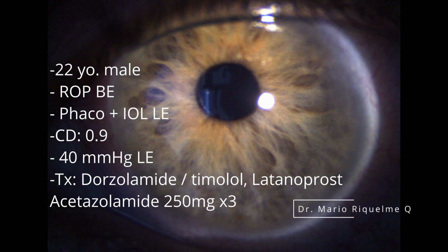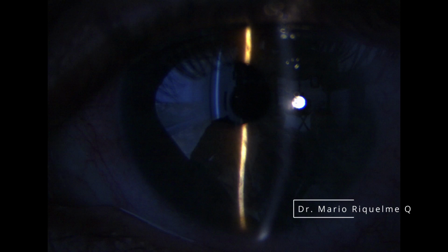He was referred to us because of very high IOP and not responding to the treatment that you can see on the screen, with maybe an urgent surgery recommendation in the left eye. We can see a very deep anterior chamber, which is an interesting finding. Also, you can see in the mid-periphery of the iris an S-shape of the anterior surface of the iris, which can tell us an idea of what is going on.